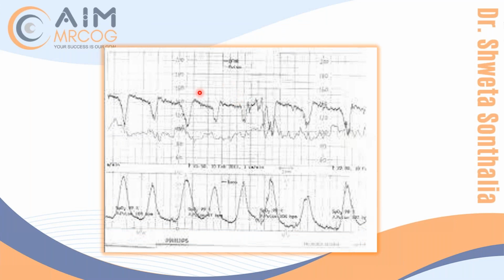Okay, now this one. Again, this is the maternal trace, maternal heartbeat, this is the fetal trace, and this is the contraction. Who wants to describe this? This should become easier now for you. Yes, anyone?